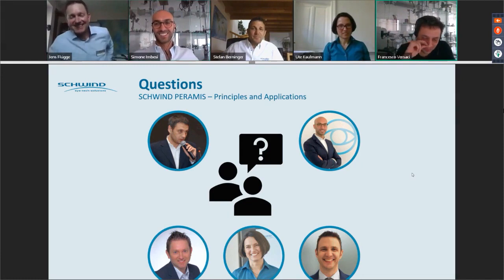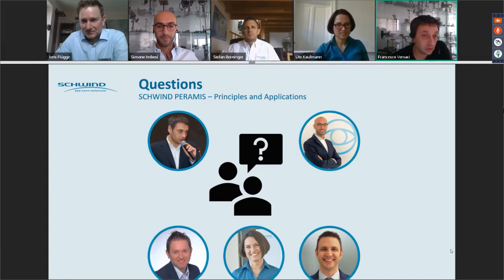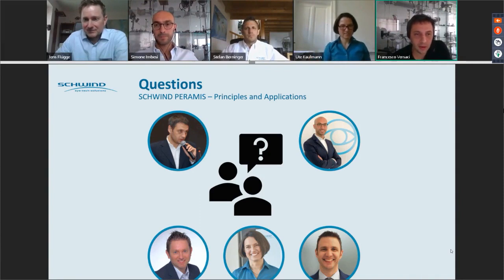I would like to add something on the two previous questions. The first one about keratoconus. If the keratoscopy is not too bad, so if we can recognize the integrity of the rings, the measurement of the keratoscopy is usually good enough. So it's your duty to evaluate if the rings are correctly recognized and if the quality of the ring is acceptable for the type of measurement that we need to do.